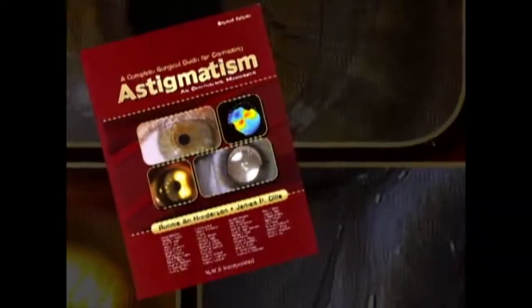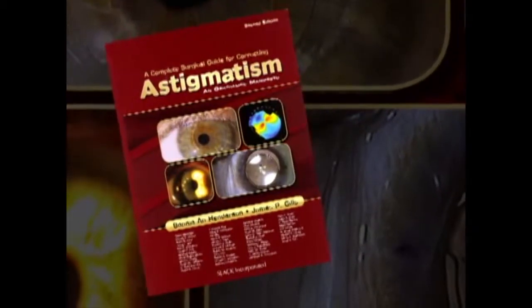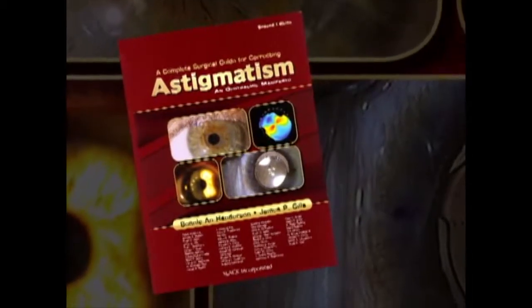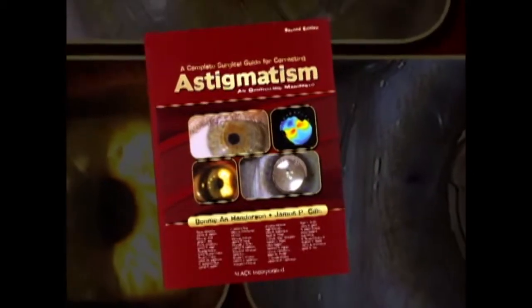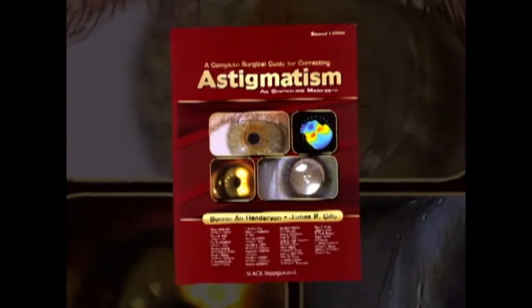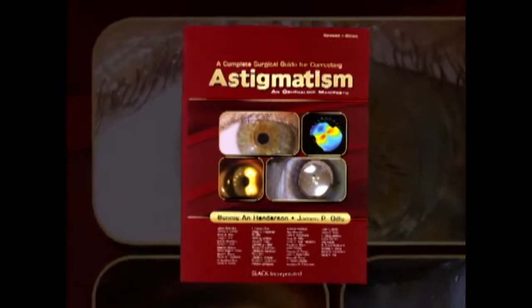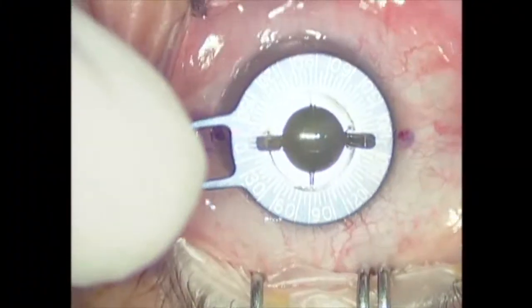The use of toric IOL in keratoconus has been advocated by one of the pioneers in the field, Dr. James Gills, who states that patients see surprisingly well with torics because when a clear zone of visual acuity is created, the brain is able to pass through the distorted areas that are caused by the extreme flat and steep zones in the peripheral cornea.